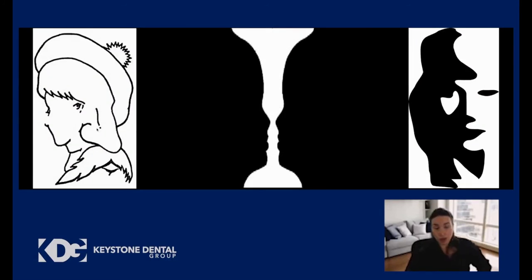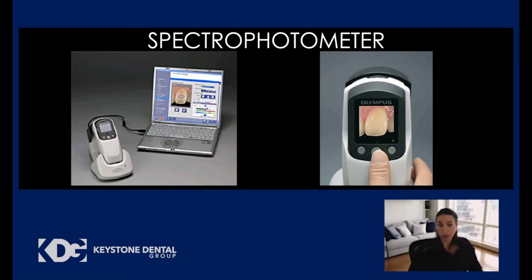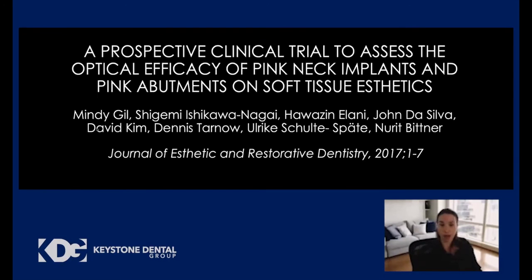Now, you should probably be thinking, well, this is really not objective, right? You can tell me there was a difference in color, but I may see it, I may not see it. It's a little bit difficult to really come to an objective conclusion. And this is the right way of thinking, because we want to have something objective to really compare the color between one aspect or the other. So we used the spectrophotometer that gave us a value for us to compare between one aspect to the other.